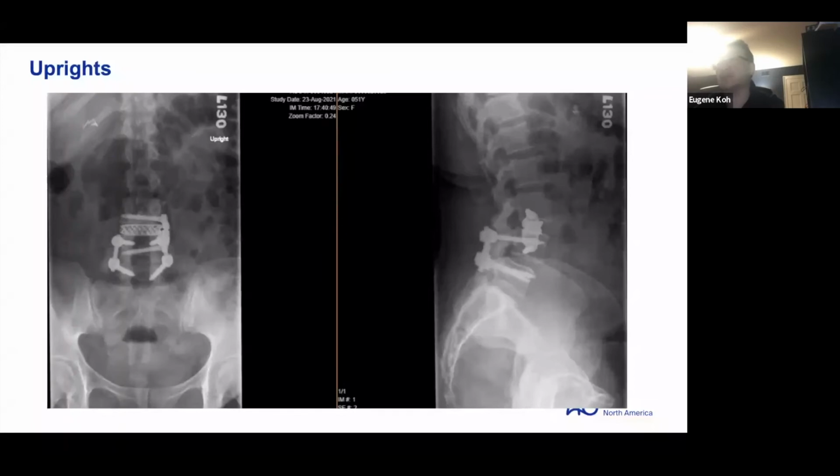I think these lateral-based approaches are great at L2-3 and L3-4. At L4-5, I have a hard time sometimes dealing with the instrumentation because you're dealing with the iliac crest. You're also dealing with the lumbar plexus at that time, and to map it out specifically and not injure the lumbar plexus, I think it gets tricky around L4-5. So I think it's great at L2-3 and 3-4.